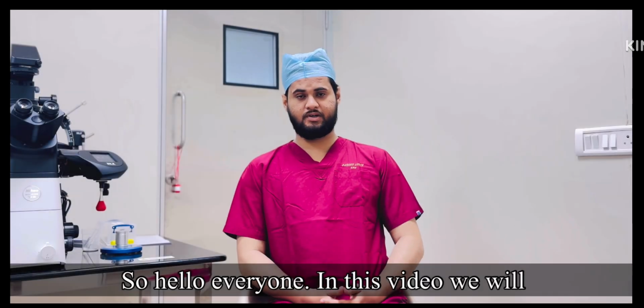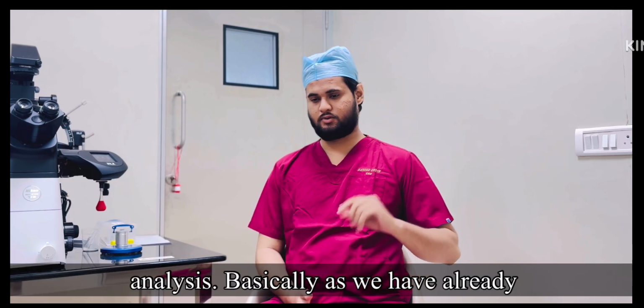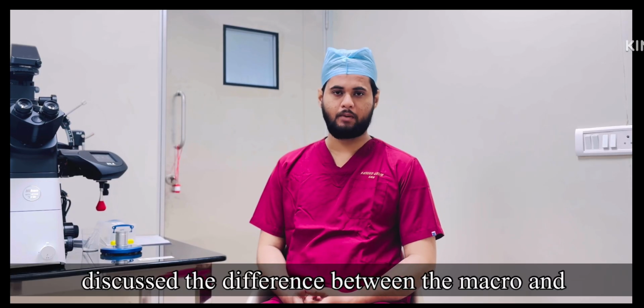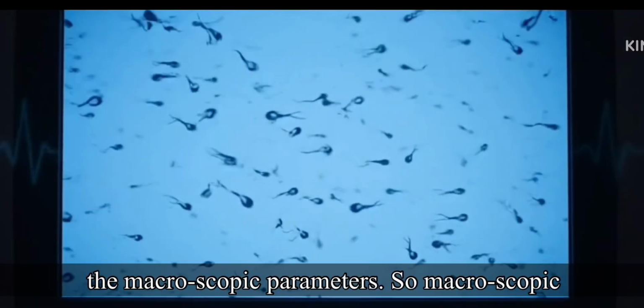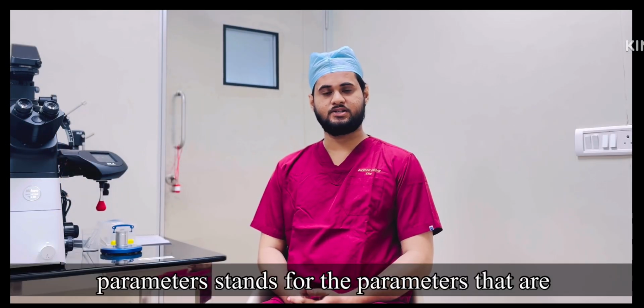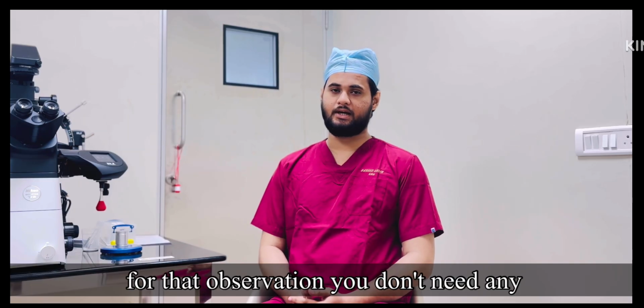Hello everyone. In this video, we will discuss the macroscopic parameters of semen analysis. As we have already discussed the difference between micro and macroscopic parameters, here we will only talk about the macroscopic parameters. Macroscopic parameters are the parameters that are visible with the naked eye, meaning for that observation you don't need any microscope.